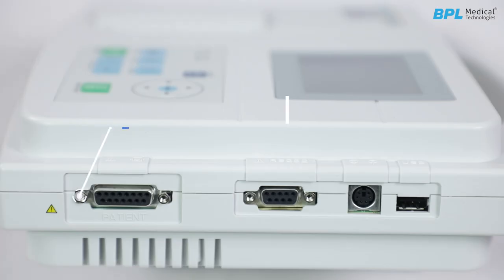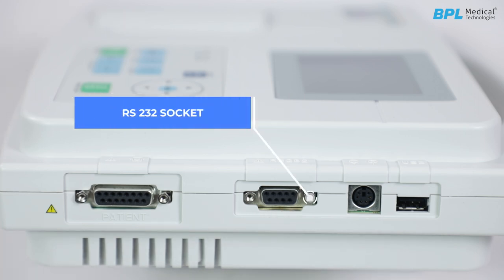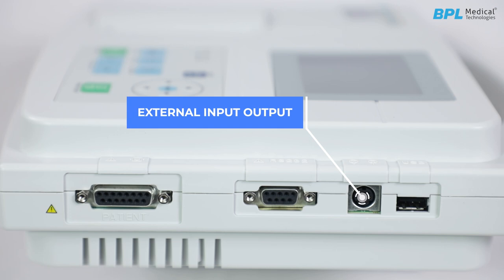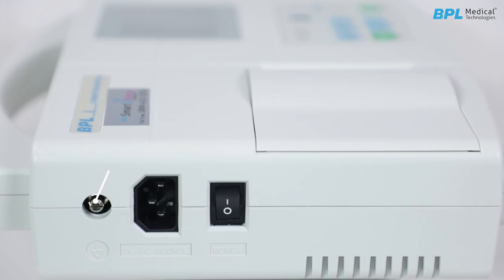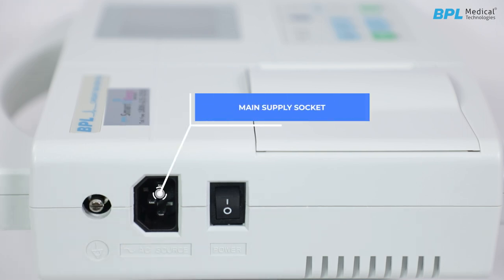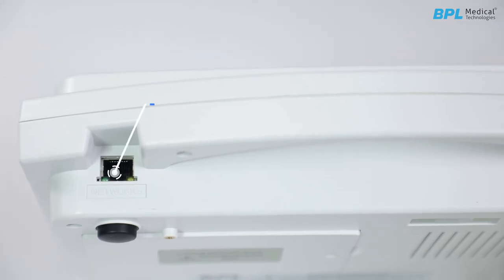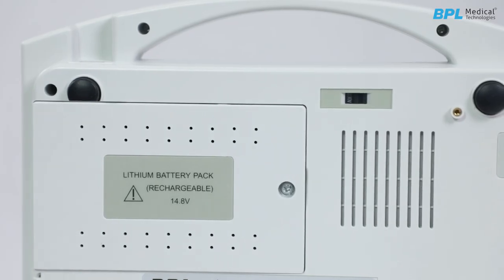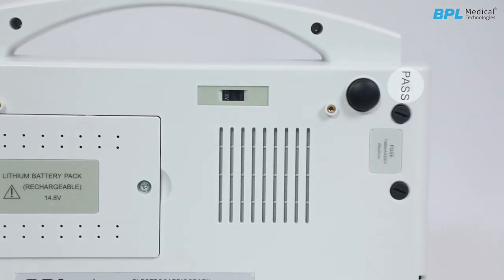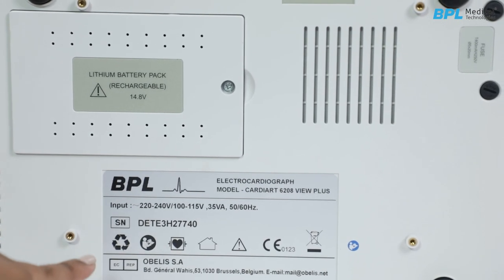At the right panel is a patient cable connector, RS232 socket, external input-output socket and a USB interface. At the left panel is a potential equalization terminal, main supply socket and mains power switch. At the top is a network port located near the handle. At the bottom panel is a battery compartment, heat emission hole, fuse and VPL label.